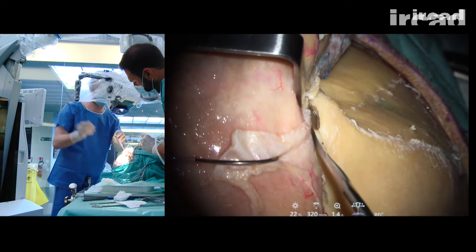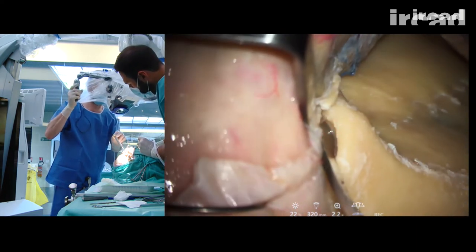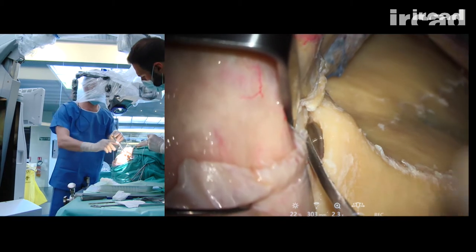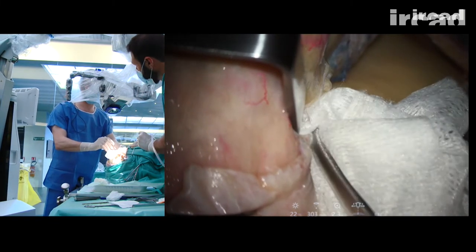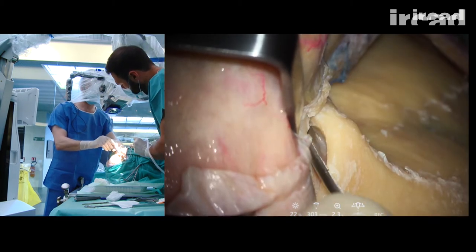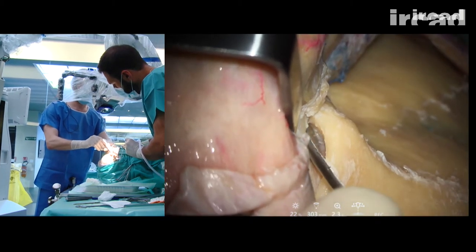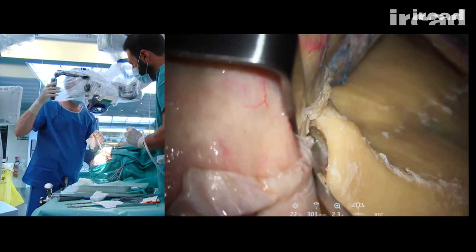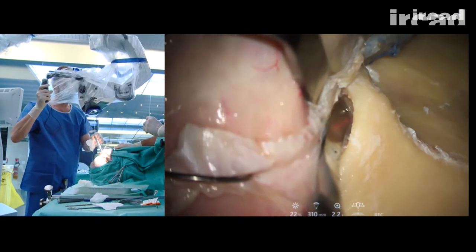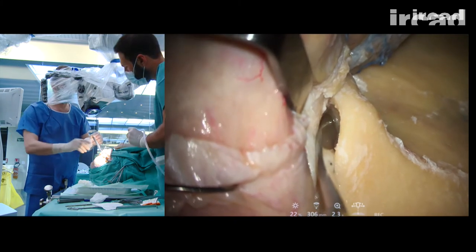So, I can really have some control of the tip of my instruments, which is most important to preserve the periorbita. Otherwise, it's difficult to keep the periorbita intact. And that's why I like to use a microscope for this step.